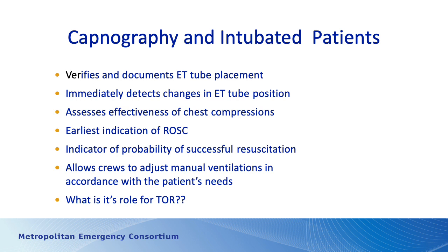Capnography, again, with an intubated patient immediately lets you know if the tube is dislodged. It's also very good for evaluating the effectiveness of chest compressions and return of spontaneous circulation. It's also an indicator of probability of successful resuscitation. So if your capnography is less than 20, less than 10, and stays there during your entire 20-30 minute resuscitation, that patient's much less likely to survive the arrest.